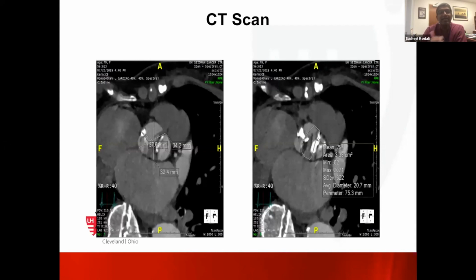And so that distance, to me, when I'm doing a balloon expandable, I look at, because sometimes we always learn by our own stupidity and our own mistakes. One time I had a sinus that was enormous, and it was a right non-fusion, and I put a Sapien, and I included the left main because it didn't expand in that direction at all. Even though the sinus was enormous, the whole valve deployed towards the left side, and I included the left main.